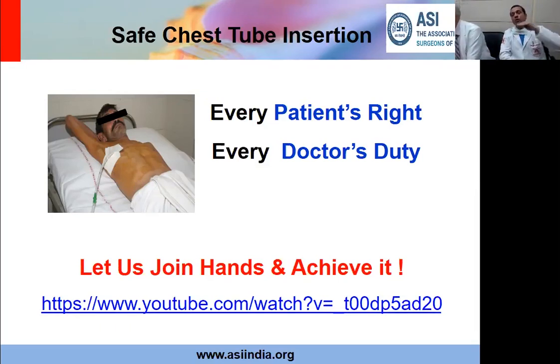But you don't want to go too high, because if the diaphragm is normally located and you put it in the fourth space, then you have a couple of spaces which are below the chest tube, and we have seen many times some amount of fluid remains in the posterior recess. So it's important that you try and have your chest tube ideally placed. An ideally placed chest tube will be one which goes into the posterior recess and the tip lies just at the paravertebral gutter. If it's in the posterior recess, imagine if the patient is in sitting position, the entire fluid will drain down, go into that space and get drained from the chest tube. So it will give you the best possible egress for the fluid.